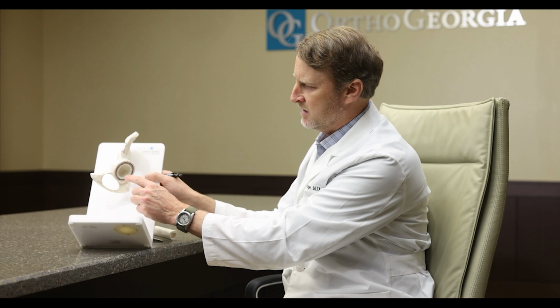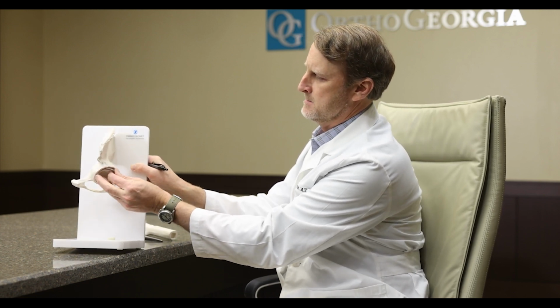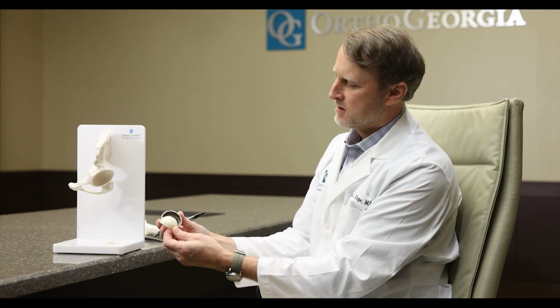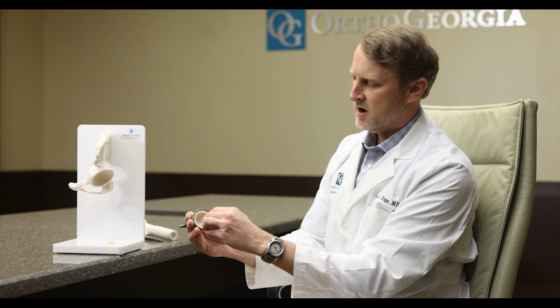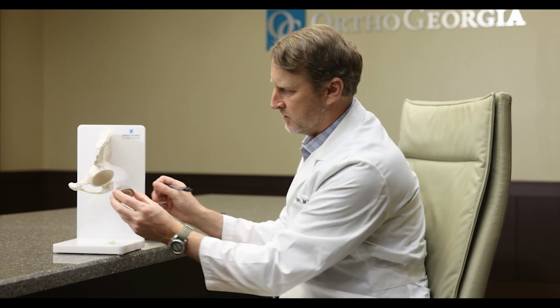That then is the cup. It has a polyethylene liner. This polyethylene liner is then affixed to the cup, and this is the bearing surface of the acetabular cup.